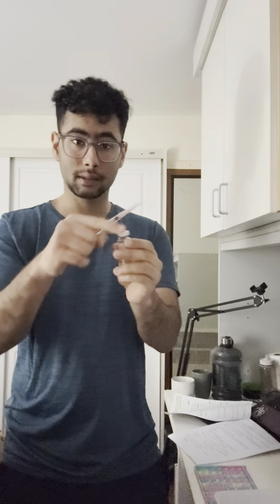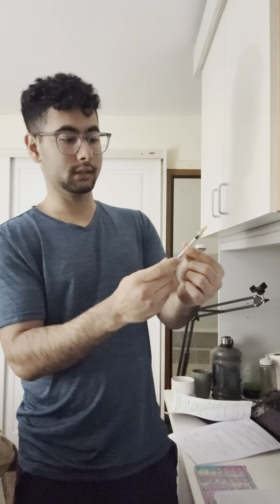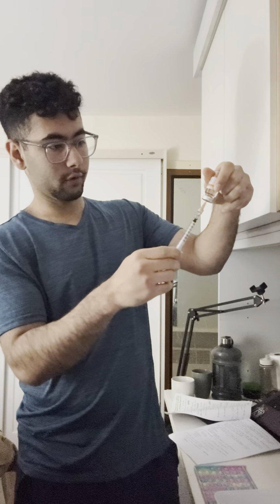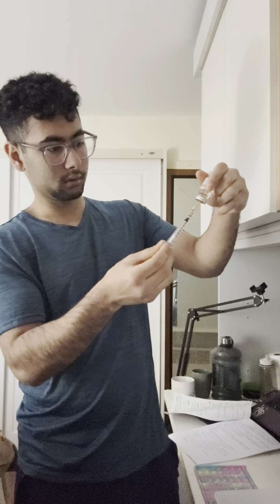So I will wipe this cap using the alcohol swabs, take it out, and then I'm going to draw it up. I'm going to draw how much I need. I need 4 units for this case. So I'm going to draw 4 units.